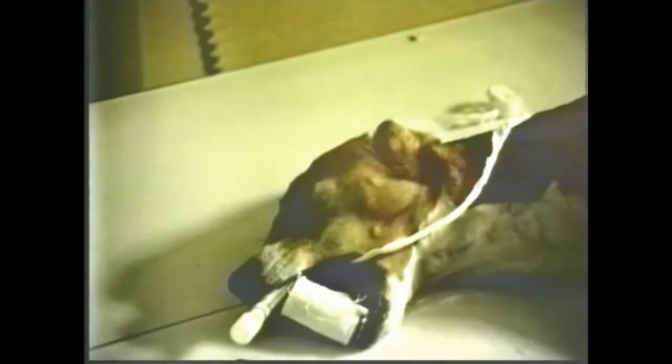This is an open mouth oblique mandible view primarily to visualize the teeth and each of the hemimandibles so that fractures could be detected. The obliquity in this case is exaggerated so as to separate the hemimandibles. The mouth is held open with 2-inch gauze. You must label the view so that the correct side is identified.